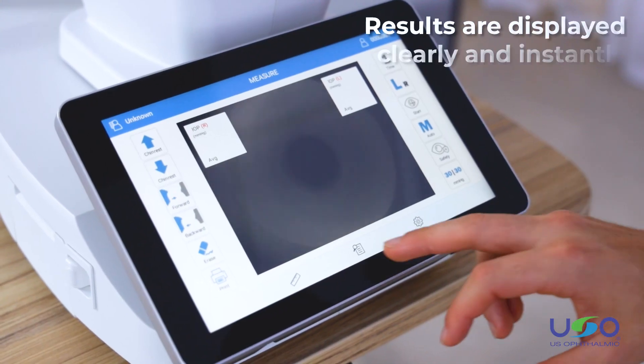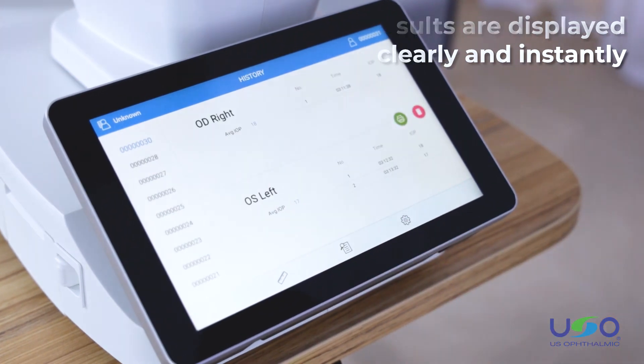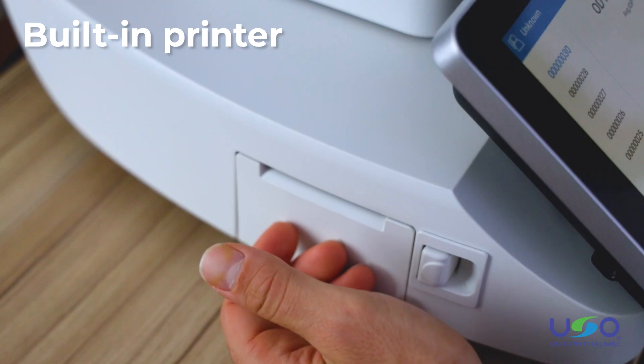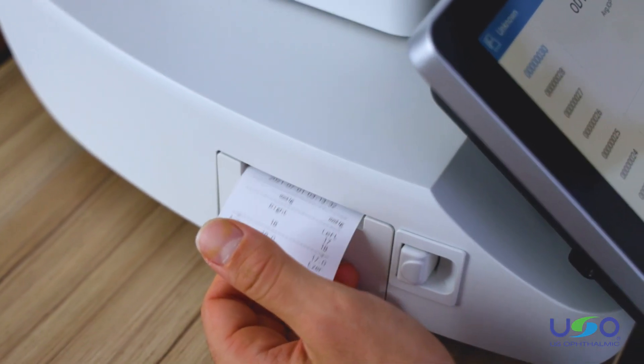The measurement results are displayed clearly and instantly on the screen. The ETN 1800 is also equipped with a built-in printer that allows the doctor to print the results immediately.